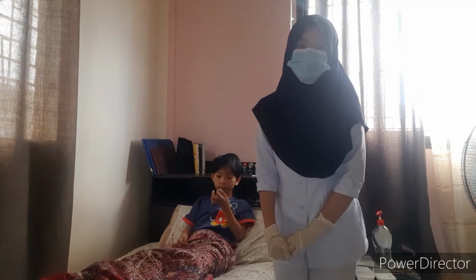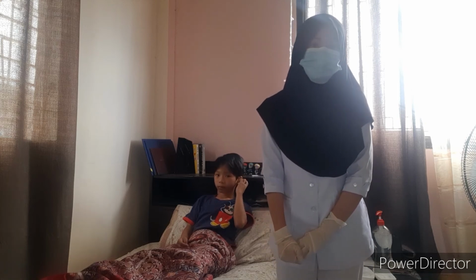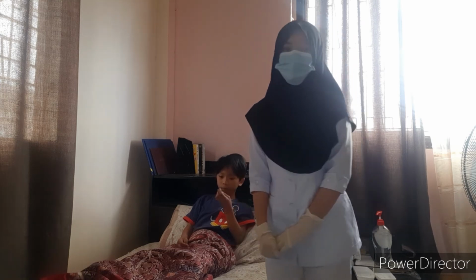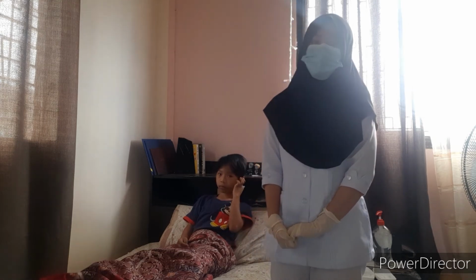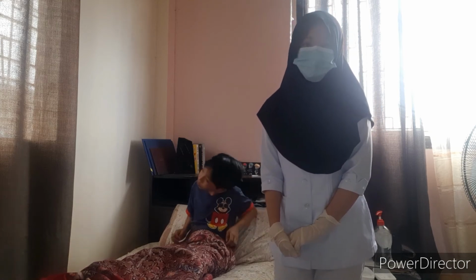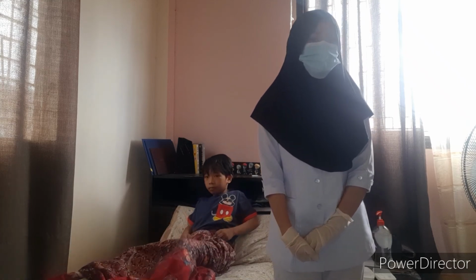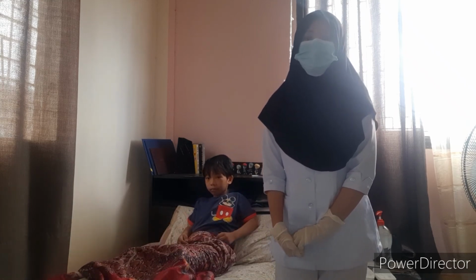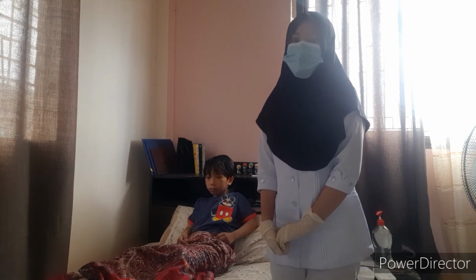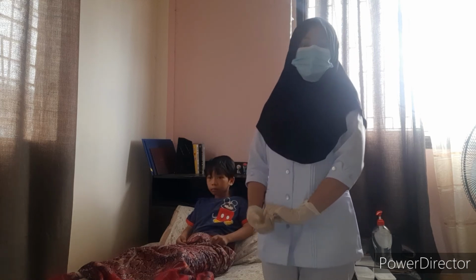So after creating a seal around the thermometer by pressing it against the canal, wait for it to take a reading and beep, then the reading appears on the unit screen. So this is to assess the result of the reading. For an ear thermometer, a new ear probe cover should be used for a different person. The ear canal must be pulled straight while measuring. So this is to avoid the spread of contamination and infection.